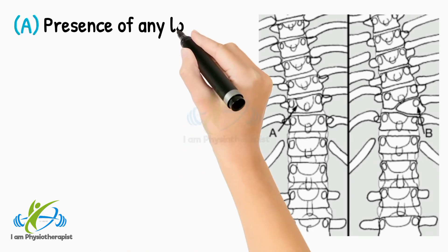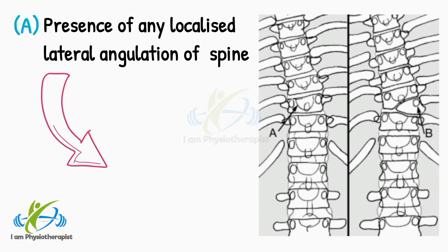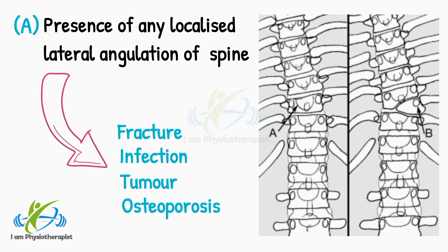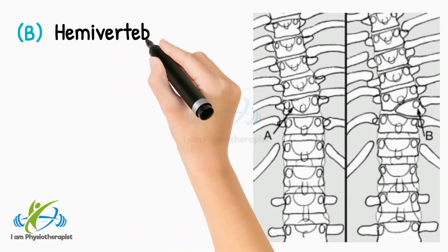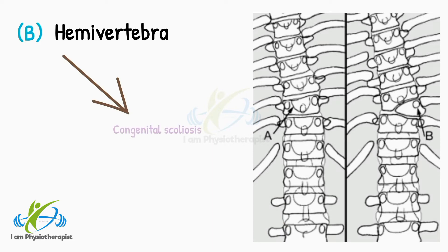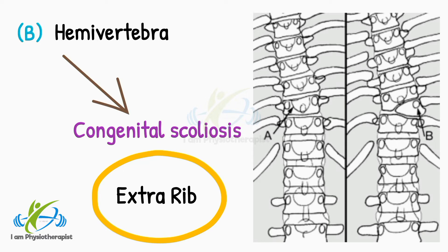In this radiograph, point A shows the presence of any localized lateral angulation of the spine due to lateral vertebral collapse — for example from fracture, infection, tumour, osteoporosis, or other causes. Point B shows hemivertebra, a common cause of congenital scoliosis, usually associated with an extra rib.